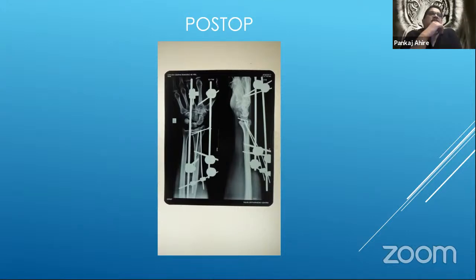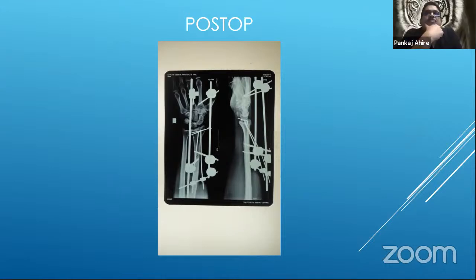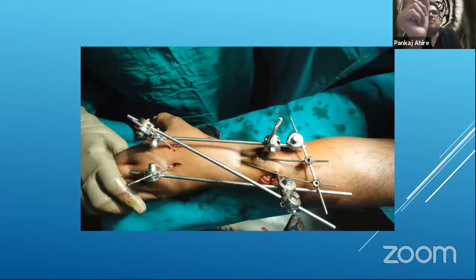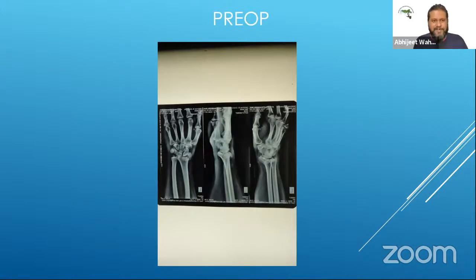Your point taken, Dr. Bhatia. So you are highlighting the issue of the stability of each part of the external fixator frame, and it would still have a parallelogram effect because they are based on a single pin in each across the joint. Point taken. So the fixator could have been rendered more stable. Is that the point you are trying to make? Yes. Yeah, Bijit, post your comment, we will go back to the preoperative X-ray and see whether any one of us would have treated this any differently.